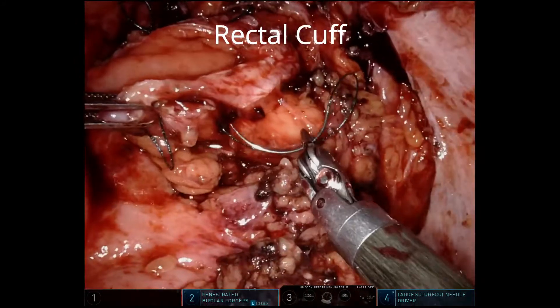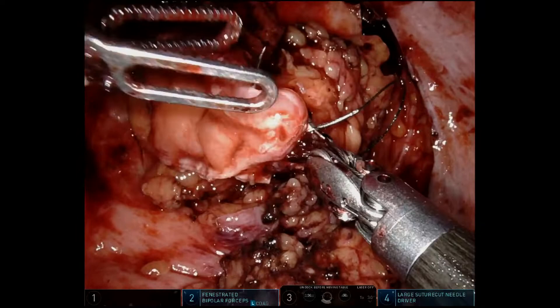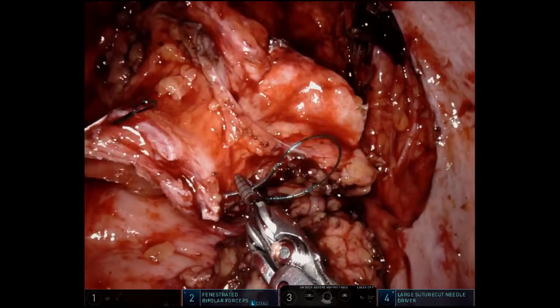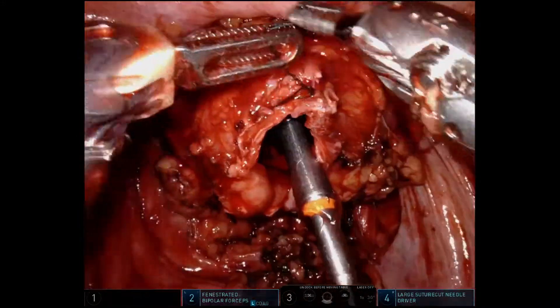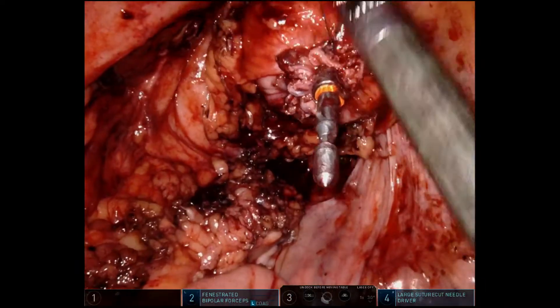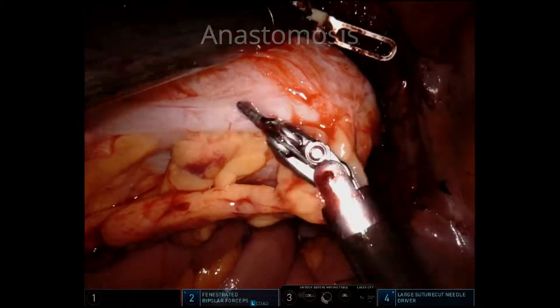Now we go down to the rectal cuff. This is going to take about seven or eight in-and-out dolphin-style sutures using the 3-0 V-lock, looping it to itself. Typically with the rectum, especially if it's thicker, we're going to do this two or three times. It's very difficult to put an endo loop that low unless you have a very seasoned bedside assist. There we're getting it tight, and now we're preparing for our anastomosis.